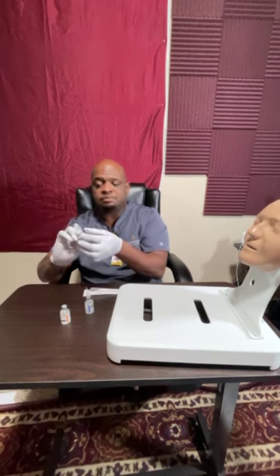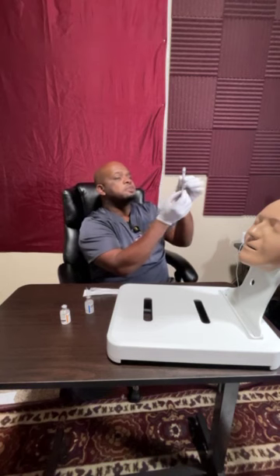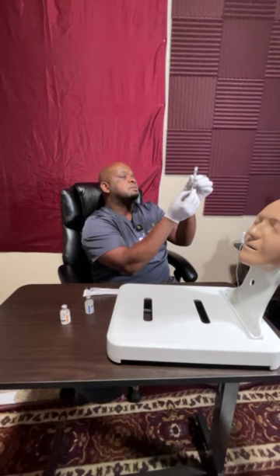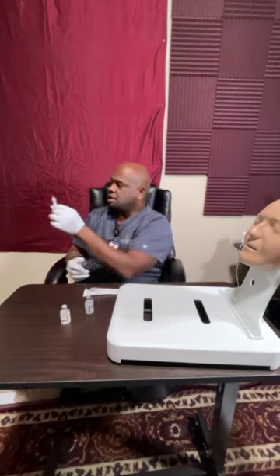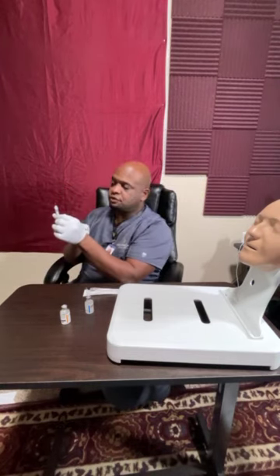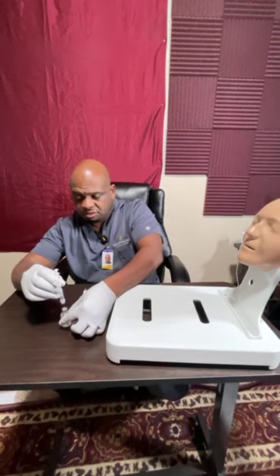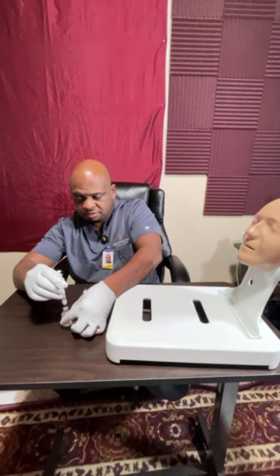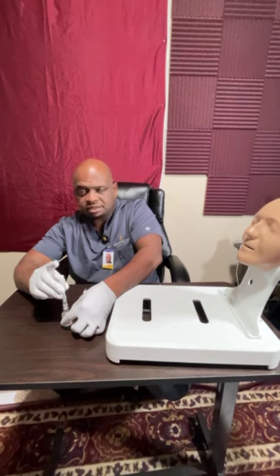Now the next one, for the regular, we are going to put in 4 units of air. 4 units of air. There you go. 4 units of air right there. Okay. The RN is here. She verified that there's 4 units of air. I'm going to put that into the regular bottle. Right? Make sure we don't bend the needle. I'm going to place that there. 4 units of air is in.